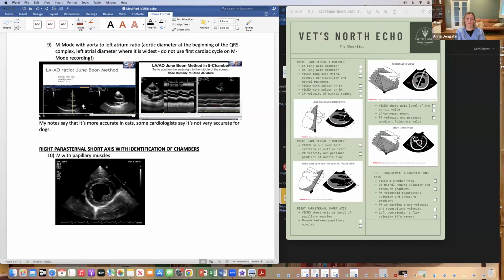Yeah. It's listed in the reviews as what we're supposed to have, but the cardiologists online were saying they think it's really unreliable in dogs. But it's just in that thing that we're supposed to submit. What Jane's referring to is we're looking at having all our sonographers certified with this International Veterinary Ultrasound Society. What's the second S?